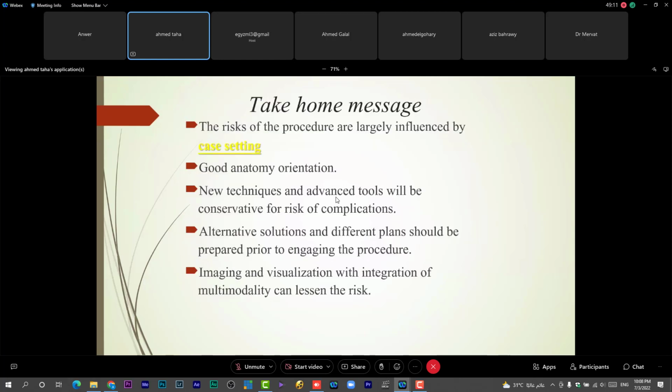Okay, here are the ideas again. Before the ablation, protocol identification: identify the anatomy before ablation with coronary angiography. It's very important, the epicardial zone or coronary epicardial transvenous ablation. Try to identify an alternative solution, especially if the VT is intolerable.